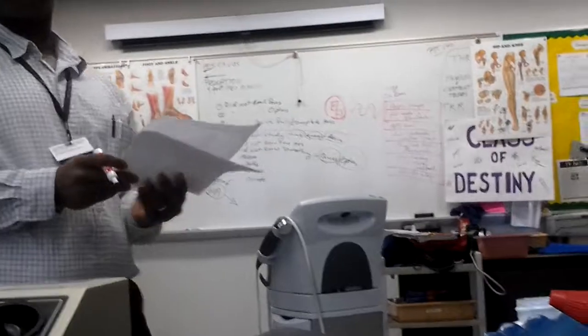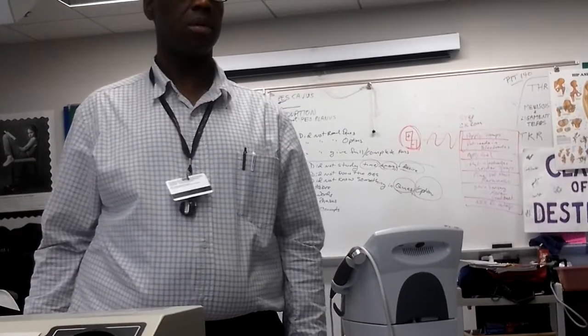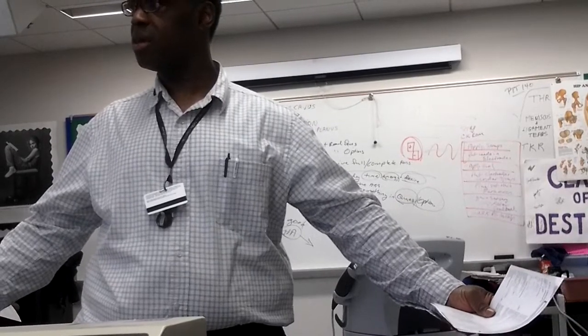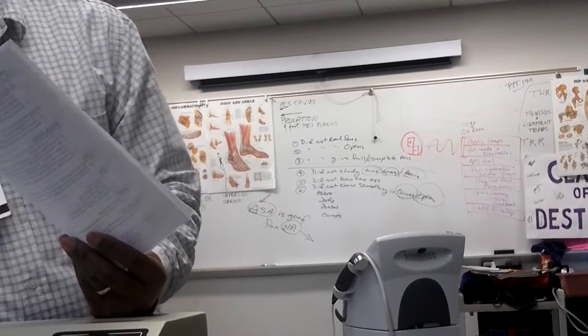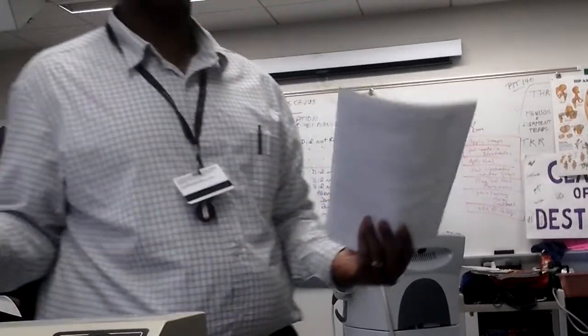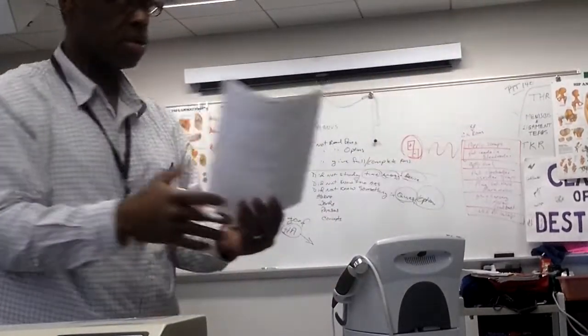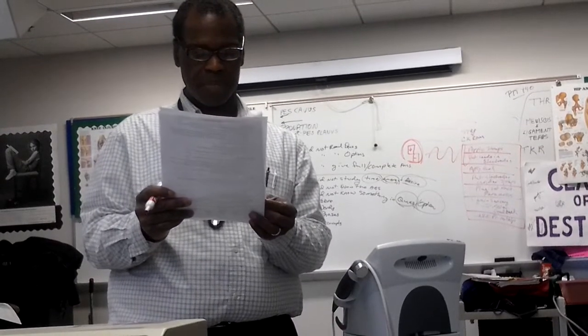Now, if I have a 700C, that big gray machine, I turn the timer, what does that do? That starts somewhat of the treatment. We still got to do the intensity afterwards. But some of these machines, I can set the timer on here, and it still doesn't start the treatment until I do what? Till I press start. Good. Okay, so just know the difference between what certain things can do versus what it can't do.